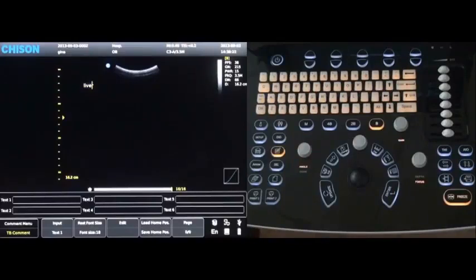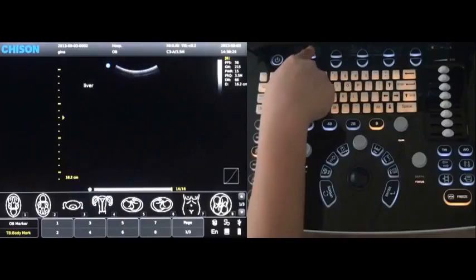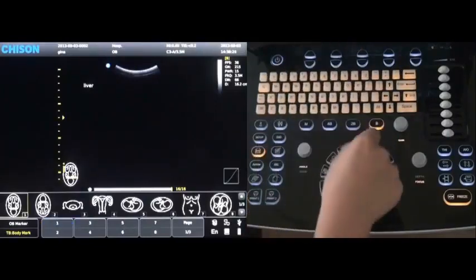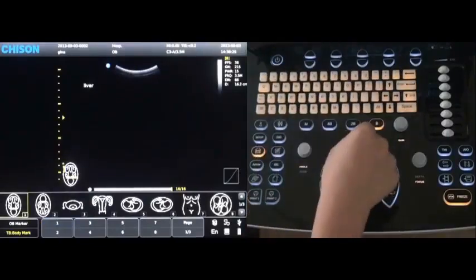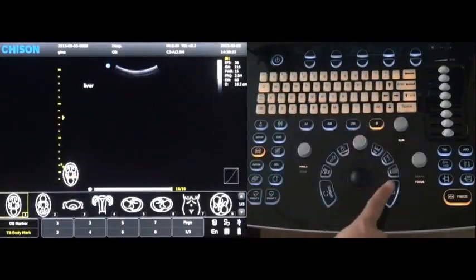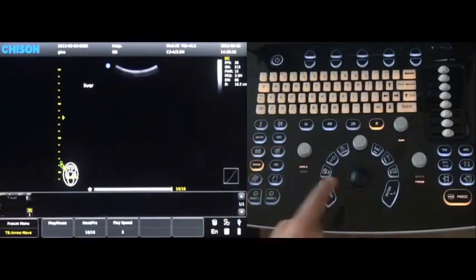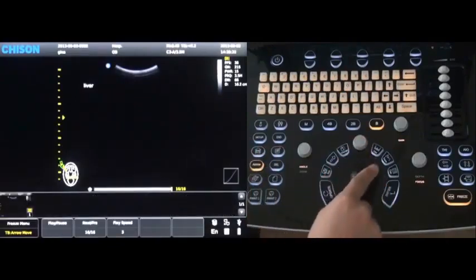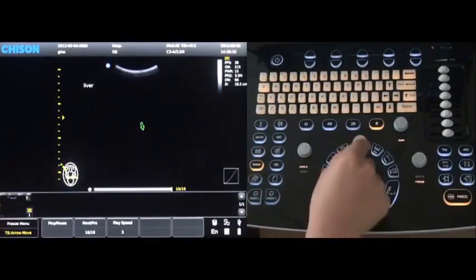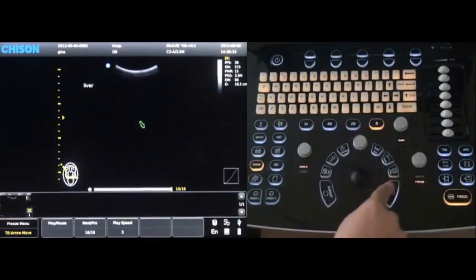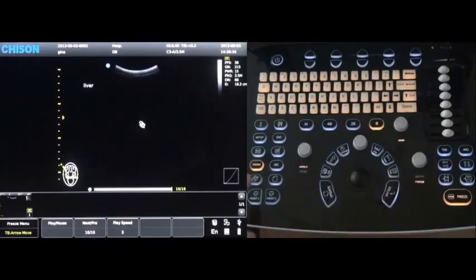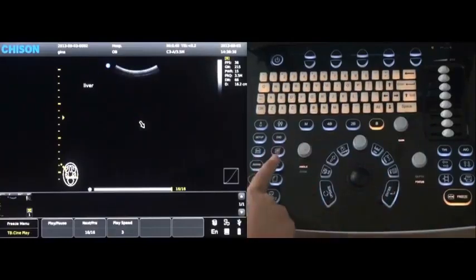Press the comment key to enter into the comment. Press the body mark key to enter into the body mark. Press the arrow key to add that arrow. You can delete what you don't want.